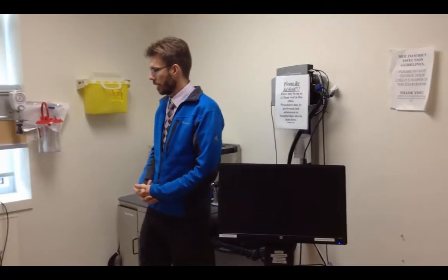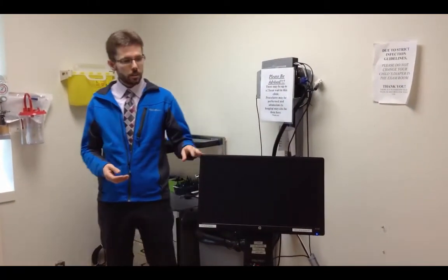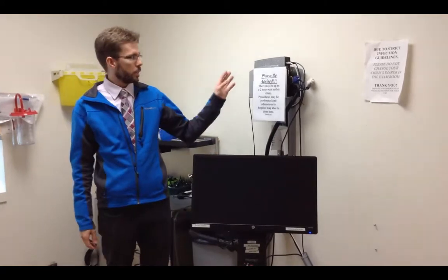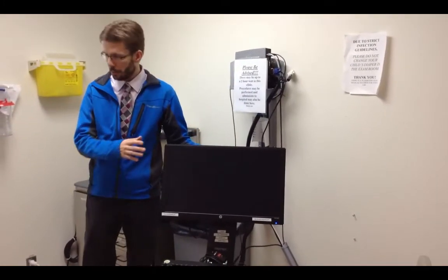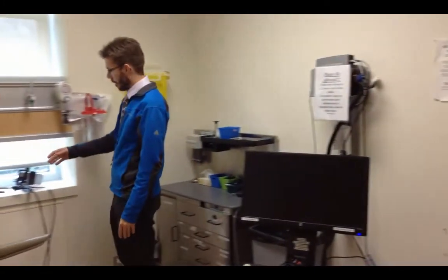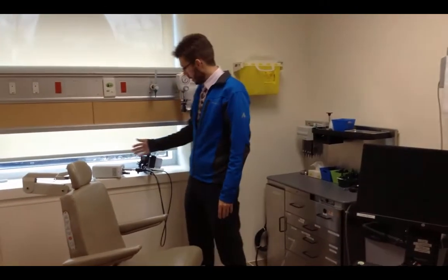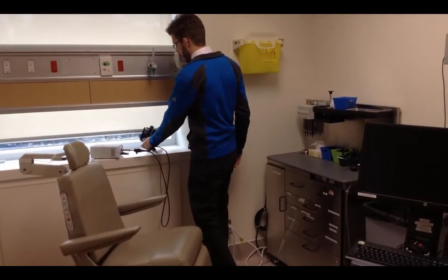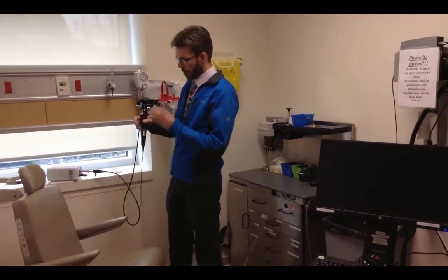What we recently started doing is making this a second endoscopy suite simply by bringing mobile equipment in. What we've done is hooked up our computer system to an Apple TV, and that's AirPlay over there. We've just brought a very small, inexpensive LED light source here, which is plugged into the wall. And you can bring in your usual endoscope that we had in the other room.